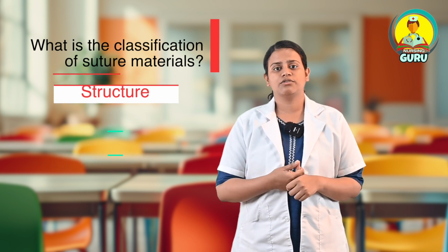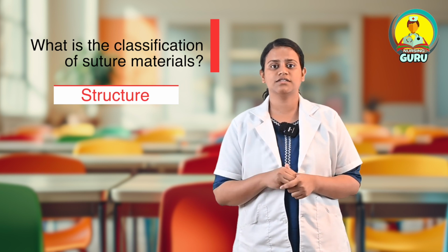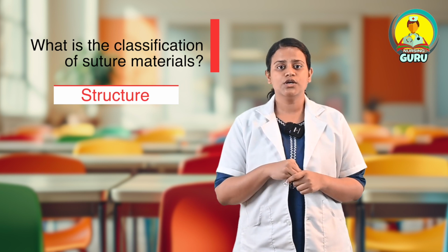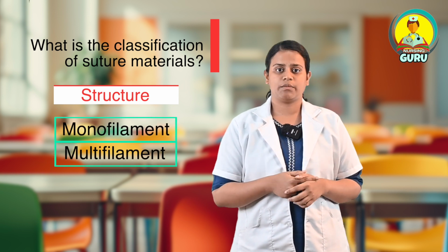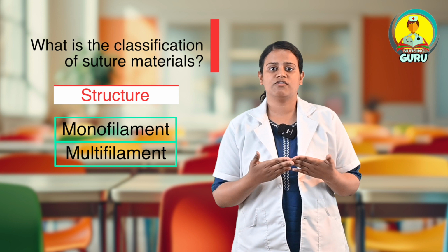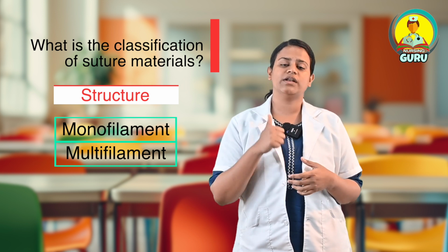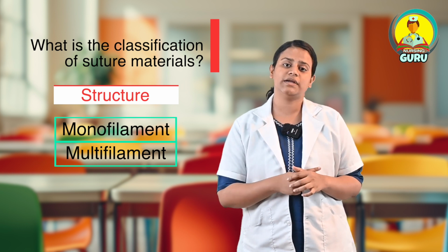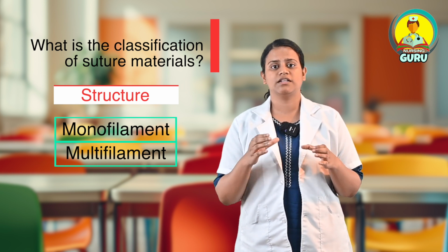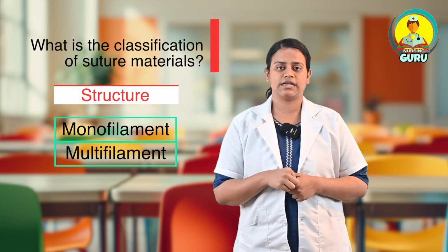Second one, according to the structure. As we have already discussed in the characteristics, the physical structures of the suture material are monofilament and multifilament. I'll repeat what is the meaning of mono and multi. Monofilament is one fiber or one filament used to make the suture material. Multifilament are multiple fibers or filaments brought together to make a single strand of a suture material.